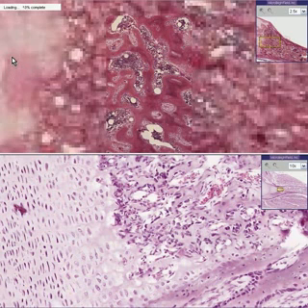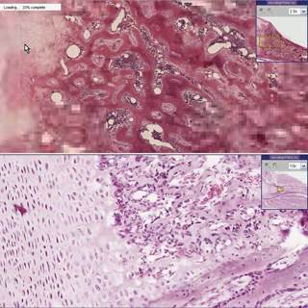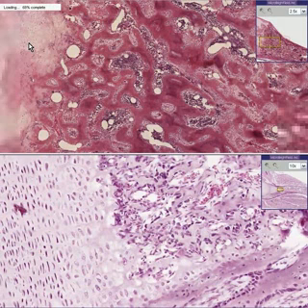You could see some chondrocytes, but there is ineffective orderly array of endochondral ossification, and as a result, this cartilage, if it's an epiphyses in a child, let's say, does not become mineralized. That is the chief problem with vitamin D deficiency, is lack of mineralization of the cartilaginous matrix.